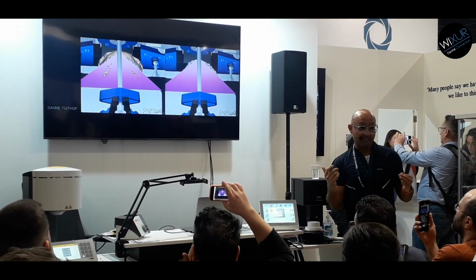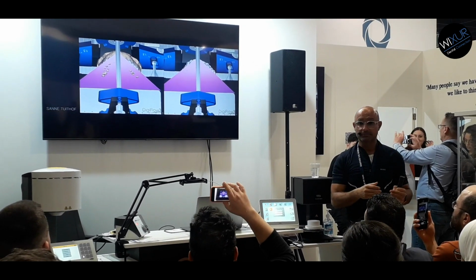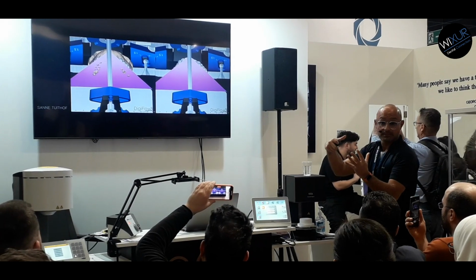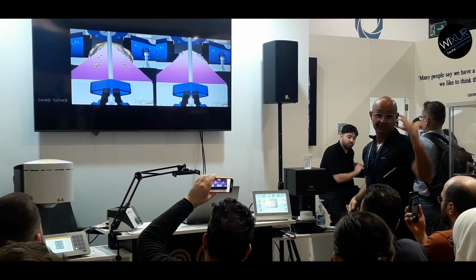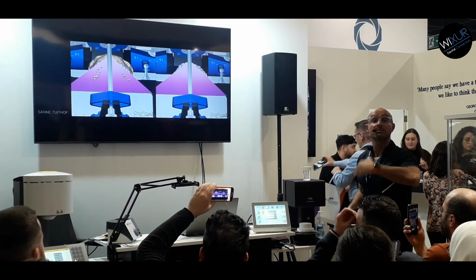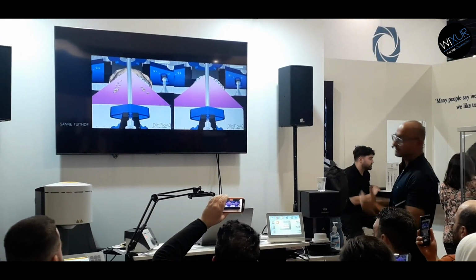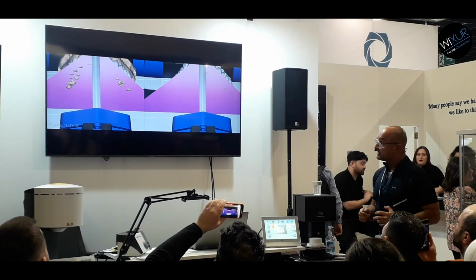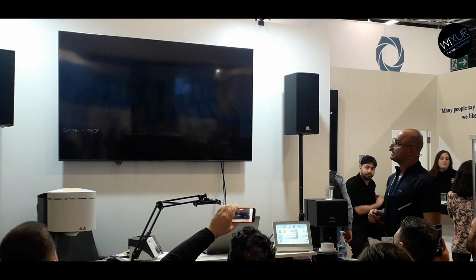We cannot do any orthodontic treatment, so we need to do it restoratively. It means we have to open the bite. She can't prep everything. When you have knowledge, you see everything becomes more and more complex because you have to fix it. So now we have to change our strategy in order to make the wax up.